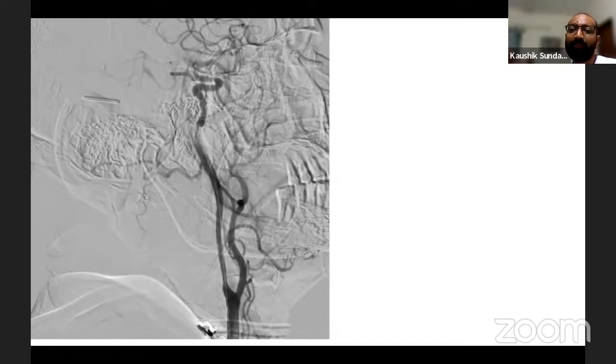Supposing this was not like this, and you're just seeing a carotid that is occluded from top to bottom, but your collaterals are not good, then you know it's a distal embolic, so you're going to only aspirate. Immediately you say we will probably finish this in half an hour, so initially we don't need a GA. Maybe we can just do conscious sedation. So it gives me an idea.